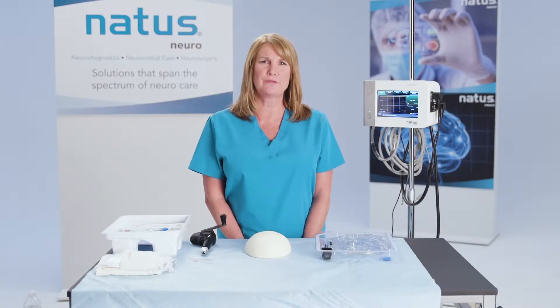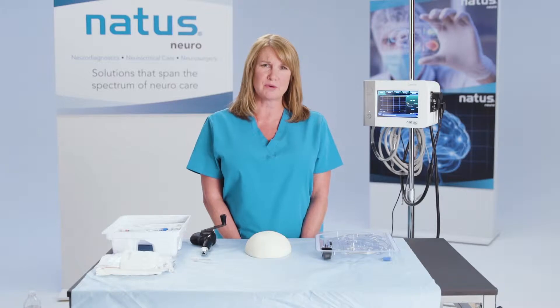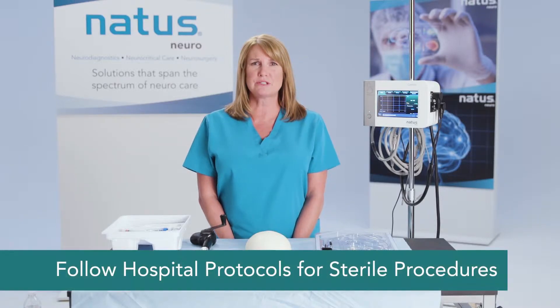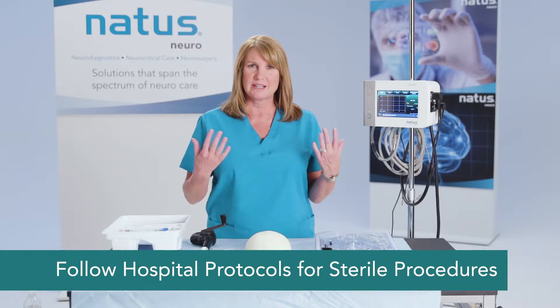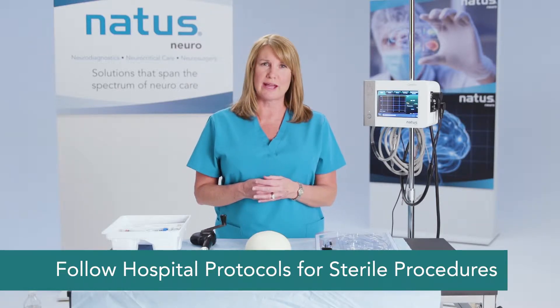I'm now going to demonstrate how to place a 110-4B series fiber optic catheter. In your hospital setting, this would be a sterile procedure, but for demonstration purposes, I won't be wearing a glove or hat or mask.